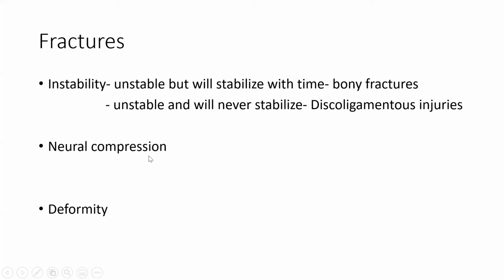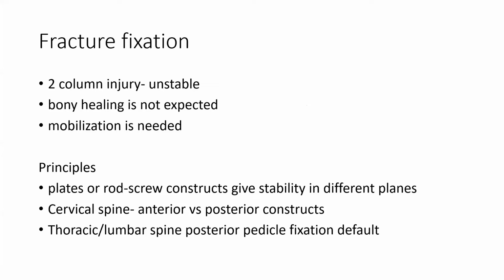Neural compression is another reason to instrument. We may decompress a foramen, for instance, and deformity. I'll show you some of those examples.